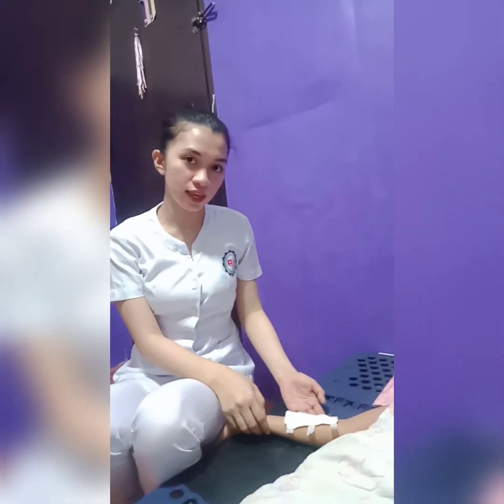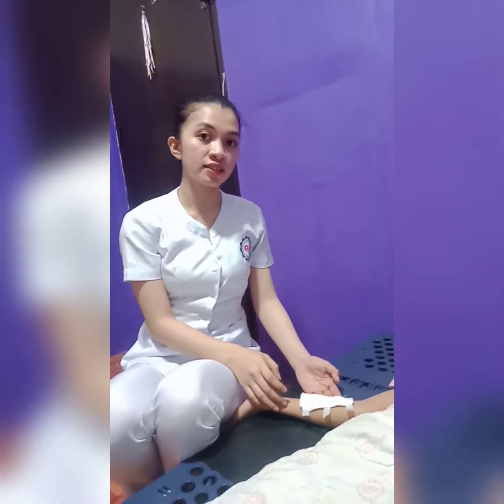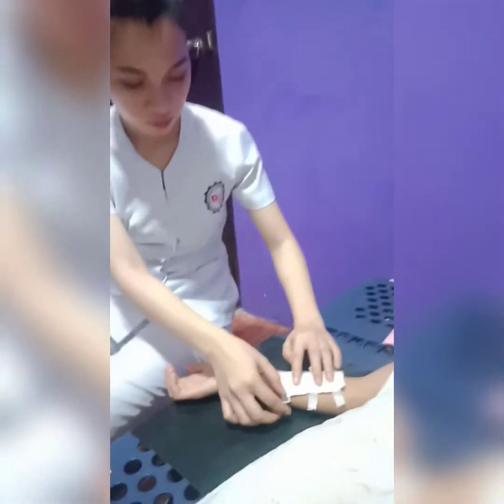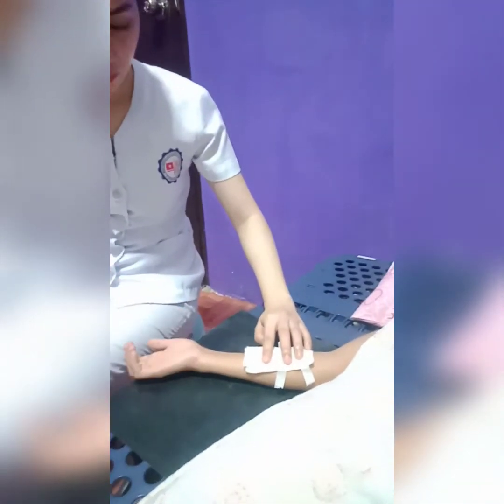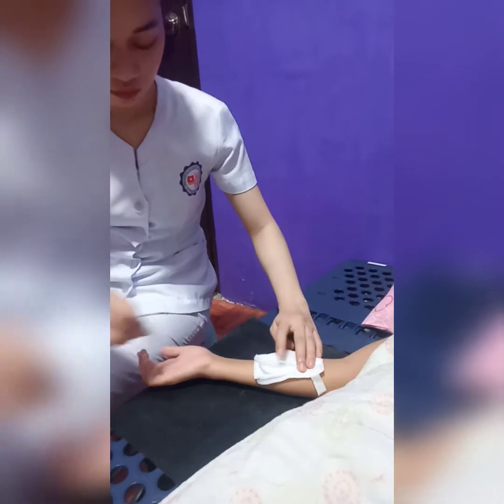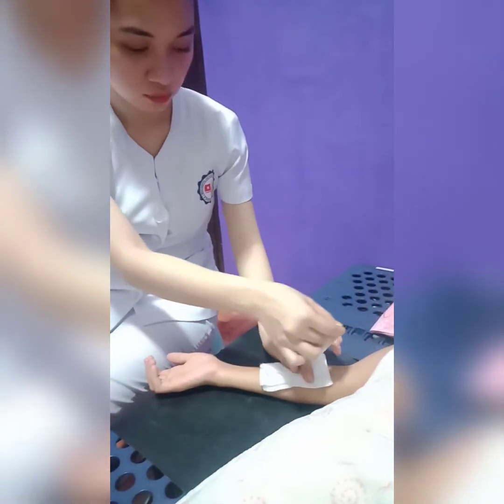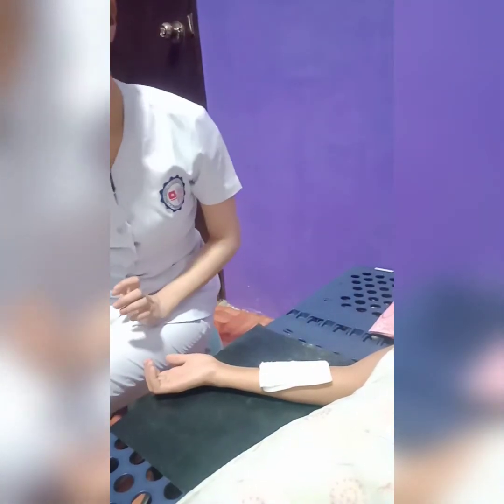Next is to remove plaster by holding down the skin and pulling the tape gently but firmly towards the wound. Then remove dressing. Disposable gloves may be used.